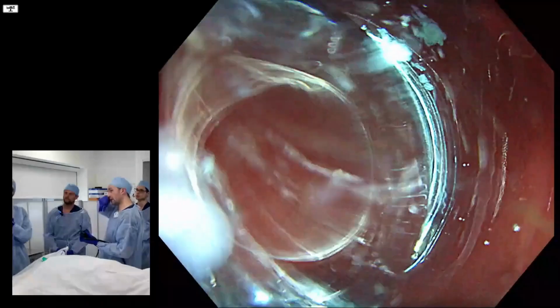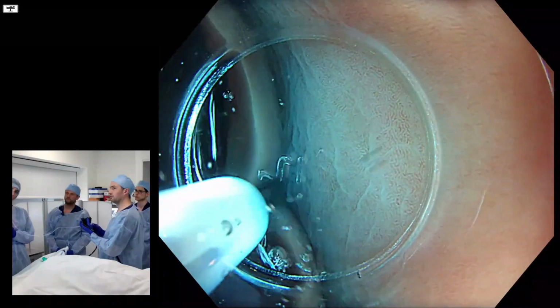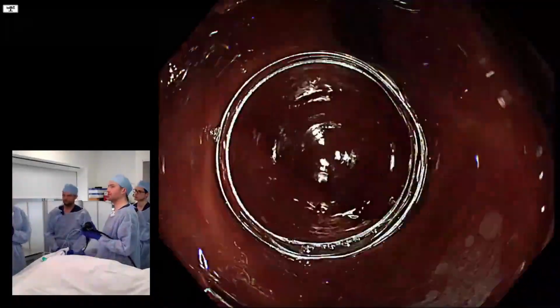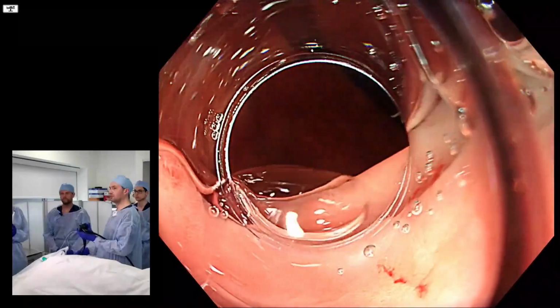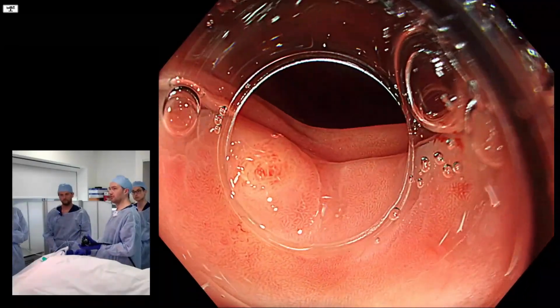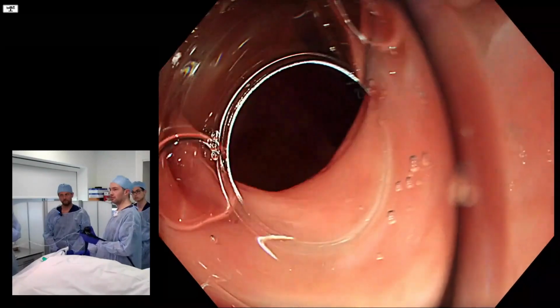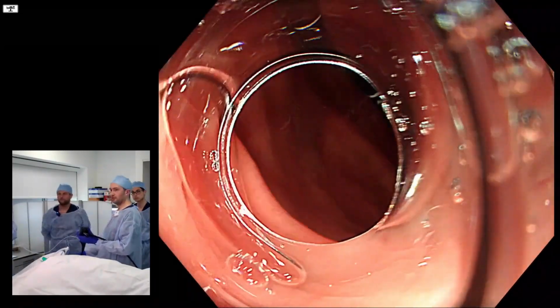I'm trying to inject, so that's not a good sign. It stops us. Go, go, go. Okay. See if it's possible to retroflex here. And can we see it in retroflexion? Yes. Yes, that is it or not? Yeah, there it is.